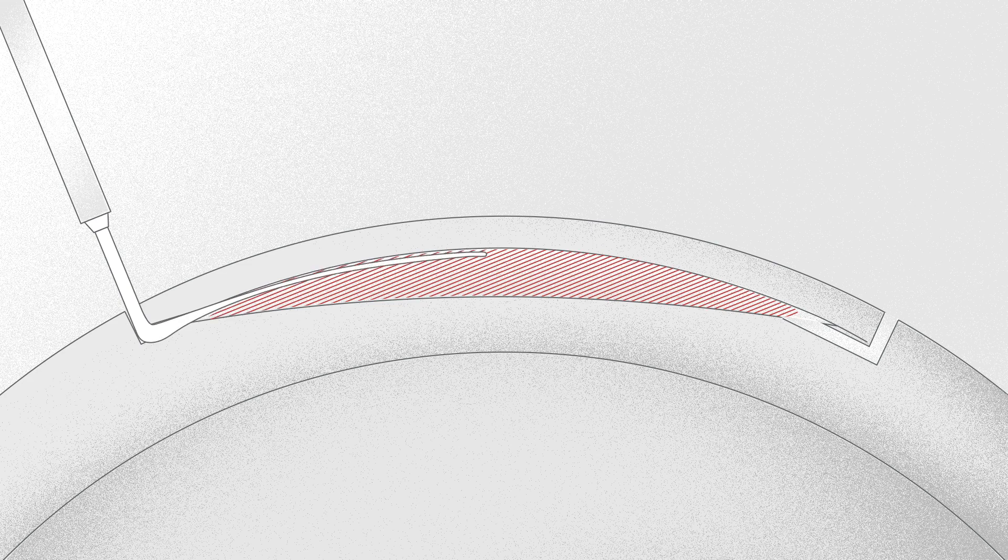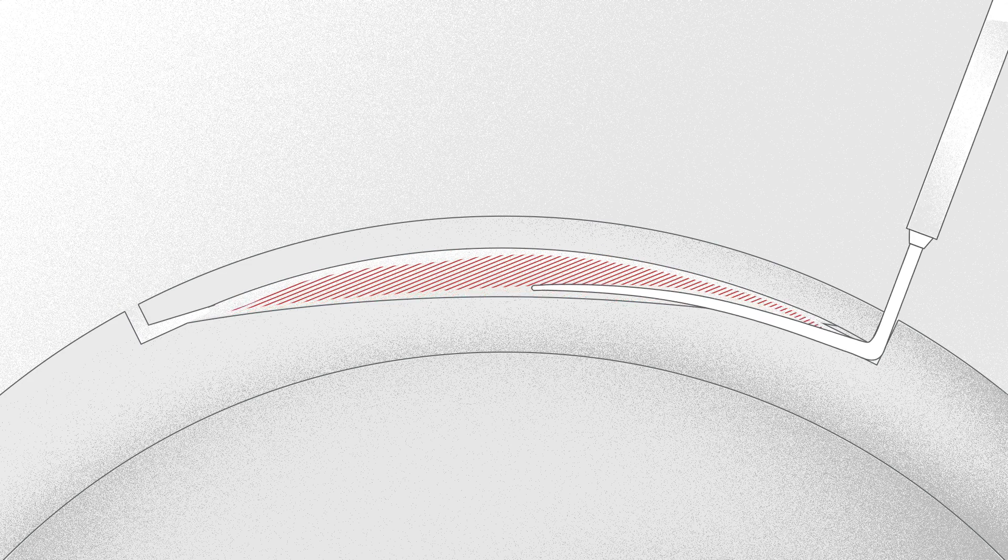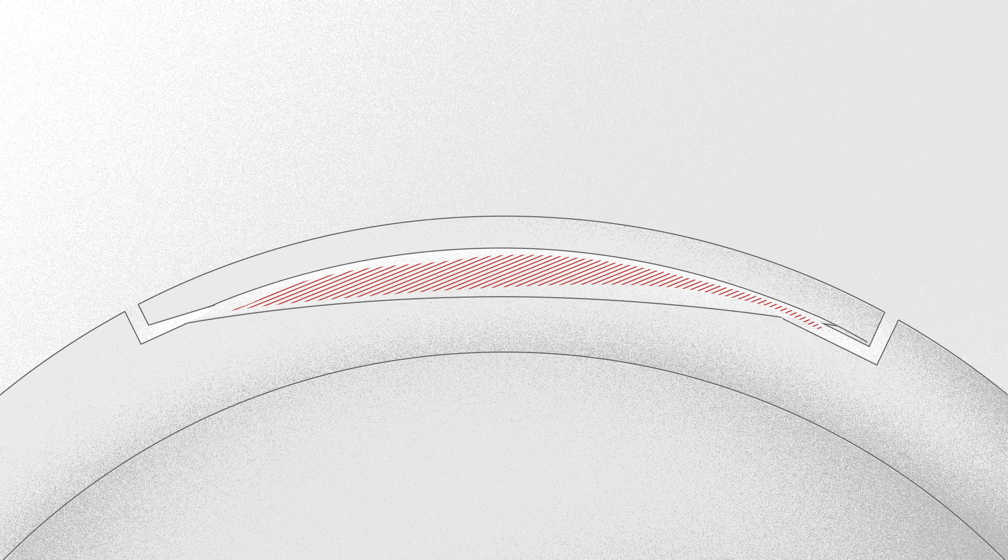Next, the surgeon inserts a dissector and carefully separates the lenticule interfaces in the anterior and posterior plane. After the dissection, the lenticule is extracted.